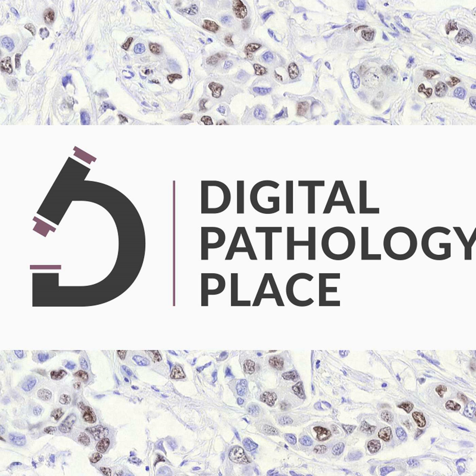Validation is about ensuring the entire process, the whole workflow, consistently does what you intend it to do. The whole process. Meaning, if you're validating a DP tool, you're confirming that your qualified system, combined with how the AI performs in your lab, produces reliable, accurate, and consistent diagnostic results. It's about the end-to-end performance in your specific clinical setting. Got it. So qualification is the gear.